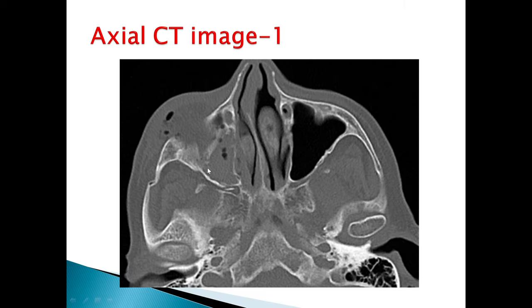The axial CT image shows fractures of the maxillary sinus walls with some soft tissue opacification. There is right periorbital soft tissue swelling and emphysema. Another finding is a minimally displaced fracture of the right zygomatic arch.